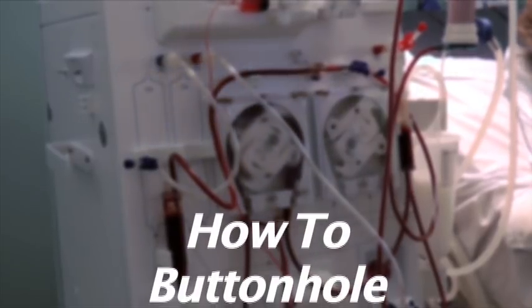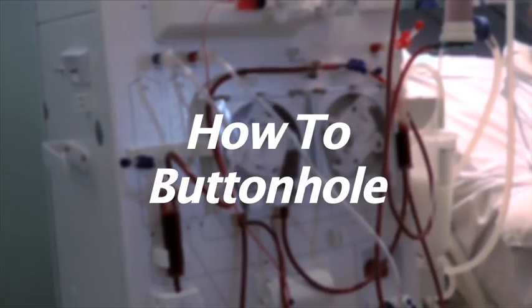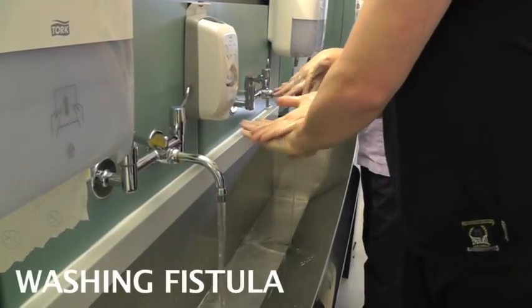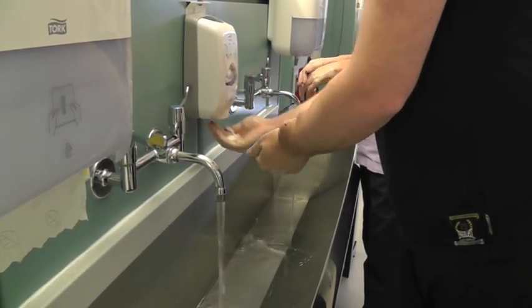This short presentation shows how to buttonhole a fistula. It is a mixture of two different patients. Patients are encouraged to wash their hands well and also wash their fistula.